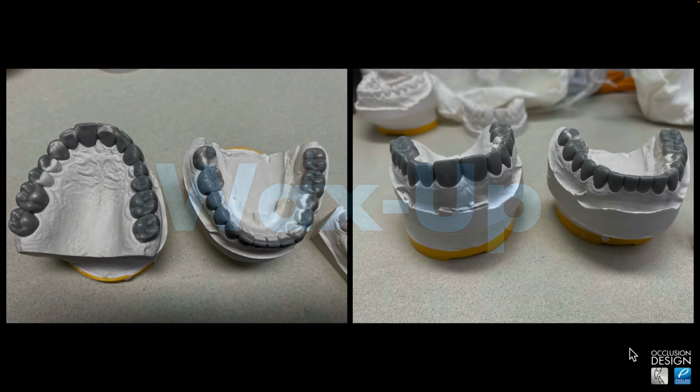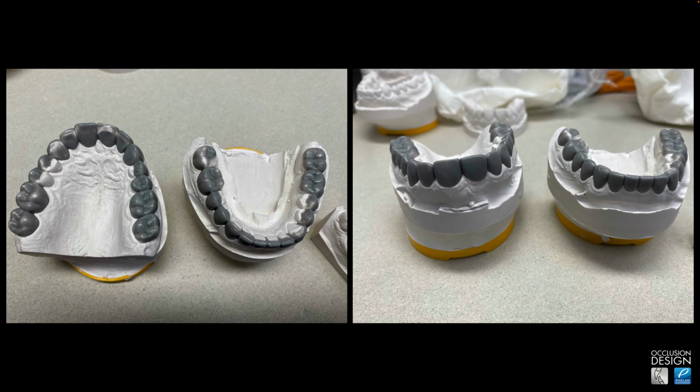We obviously start with the diagnostic wax up. This case was treated with an analog wax up. So here's some images of the wax up. They were taken on my phone. They're not the best images. I do have a couple other shots of the wax up in videos. Preparations. Again, we do preparation day 1, preparation day 2.